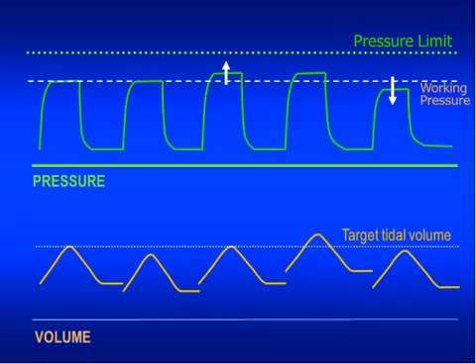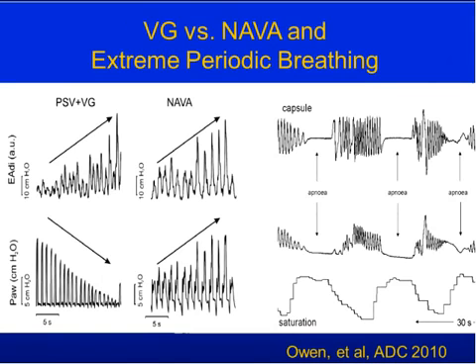This is also compensated for leak to some degree. I'll talk about leak compensation in a moment. There is real-time, within-cycle monitoring of tidal volume as well, and if it exceeds by a large amount, it will terminate the cycle. So there's, in a way, a dual control, but that's a secondary one. The primary control is on the exhaled tidal volume. So you can see that if there are large changes, it may take a little bit of time for the tidal volume to stabilize again.